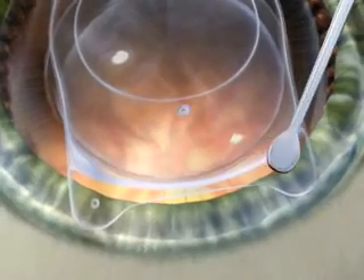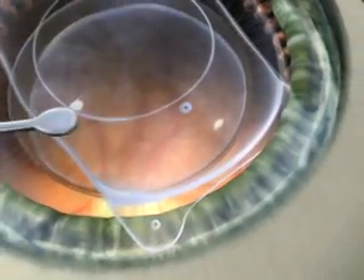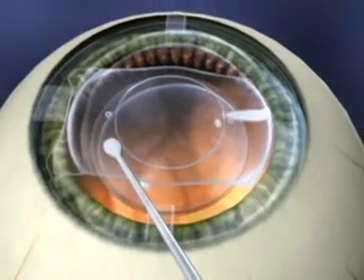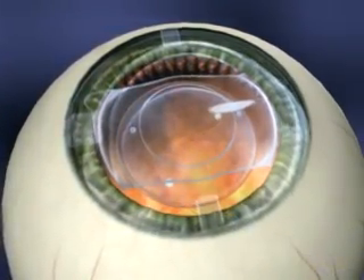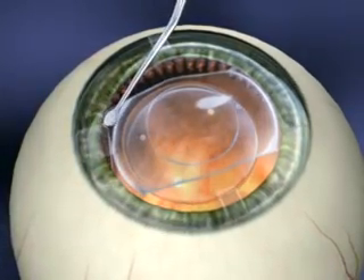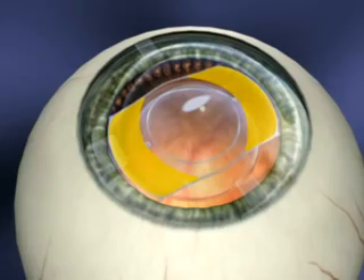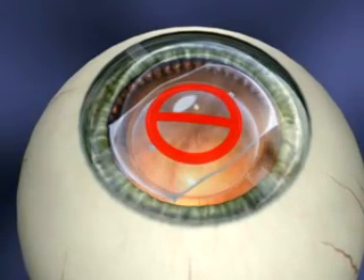Using the ICL manipulator, position the distal footplates first while the pupil is maximally dilated. Once the first footplate is under the iris, continue with each of the footplates until they are all posterior to the iris. Avoid excessive rotation of the ICL once it's in place. Once positioned behind the iris, subtle adjustments are achieved by manipulation on the lens body between the footplate and optic. Never depress the optic itself — this is the thinnest part of the lens.